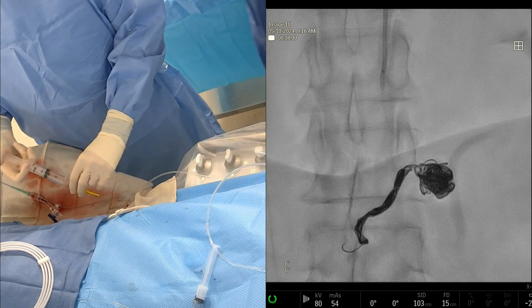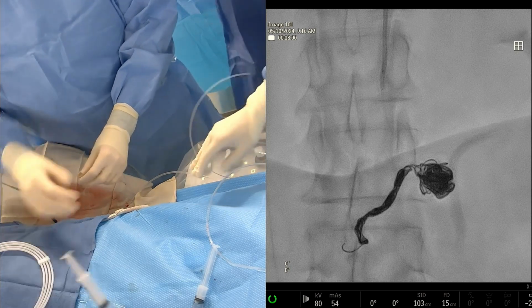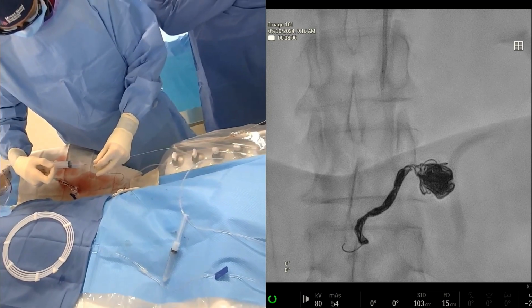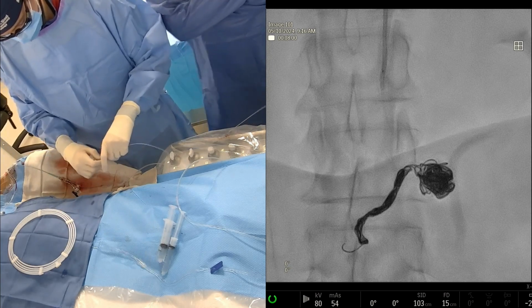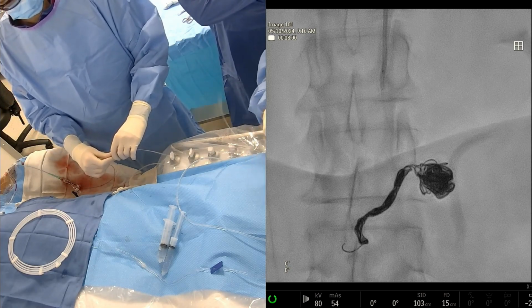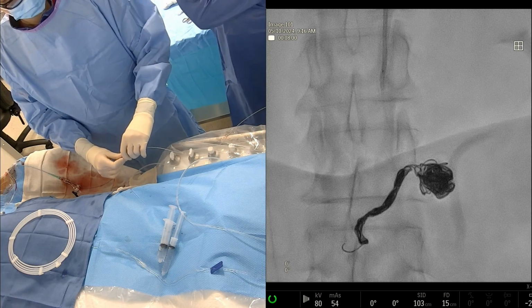Yeah, so that's the other thing. We talked about this a little bit before we set up the case about using a guide to help. I thought if the catheterizations were going to be really difficult, maybe a guide from behind would help, just in terms of not having to pull the wire every time to do runs to figure out where we're going. But you can use a 6 French guide. We have 100 centimeter and 110 centimeter 6 French guides. I think Merit makes a 110 or 125 like Sarah shape. I think it's their Ultima shape guide.